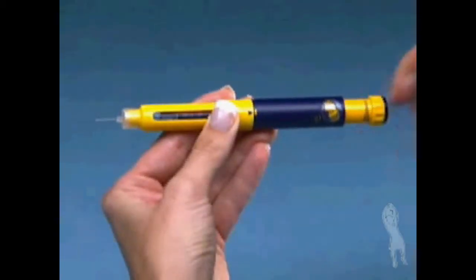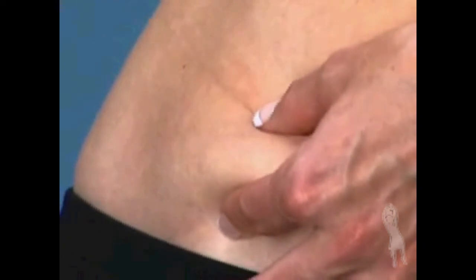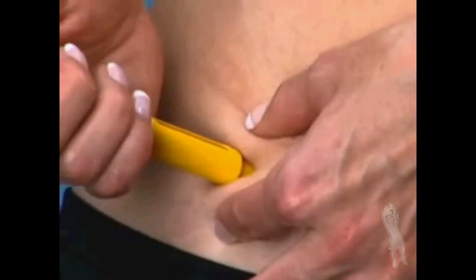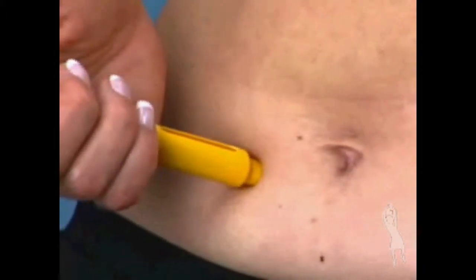Once you have set the Follistim pen to the correct dose, you are ready for your injection. Pinch the already cleaned injection site between two fingers. With the other hand, insert the entire BD Microfine pen needle straight into the skin. Release the pinch.